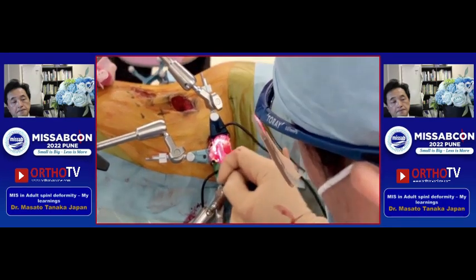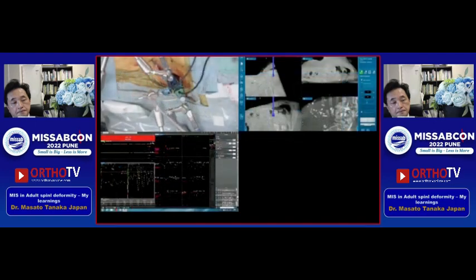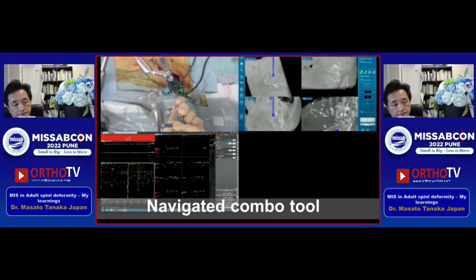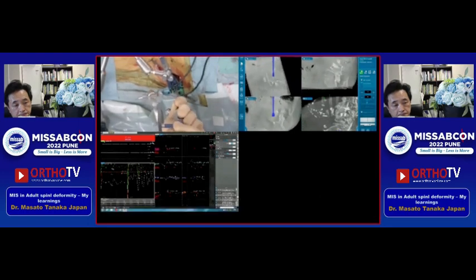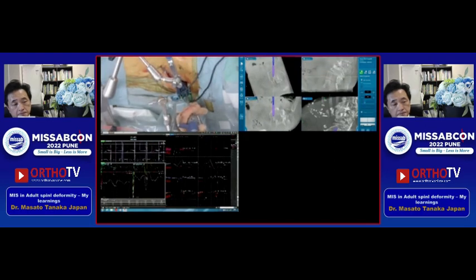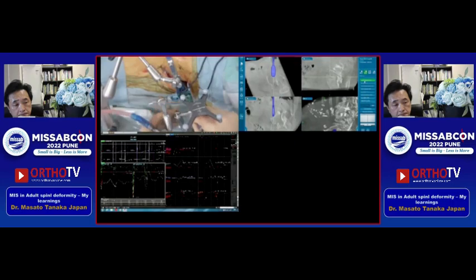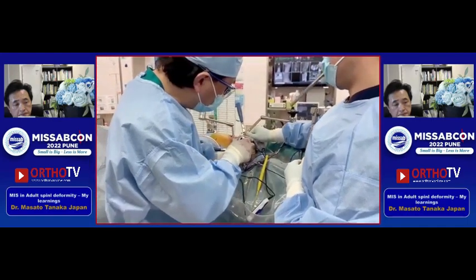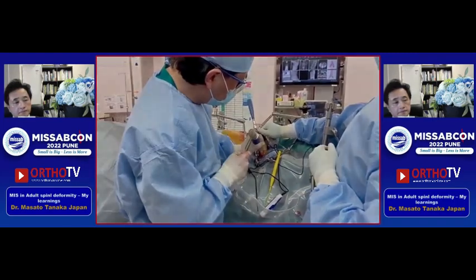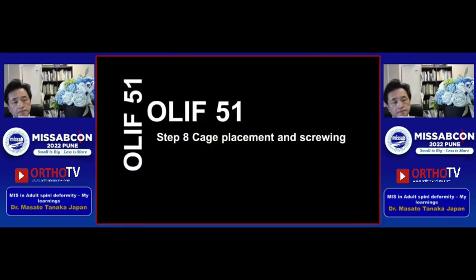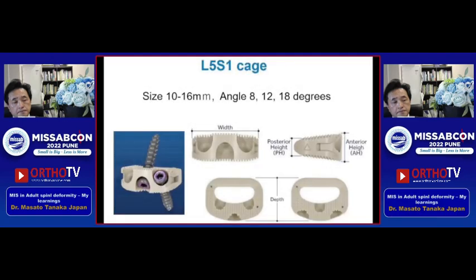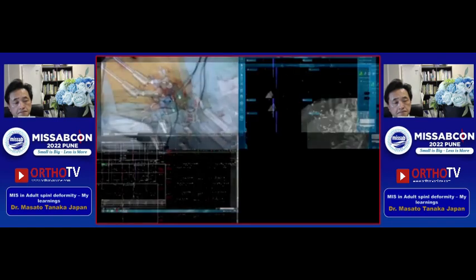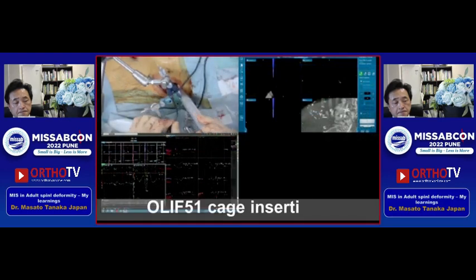This is the ring curette. This is a navigated combo tool to make the end plate smooth. This is the navigated shaver, and this is the navigated trial. For the L5-S1 cage only, the size is from 10 to 16 mm, and the cage angles are 8, 12, and 18 degrees. The cage is inserted with a mallet.